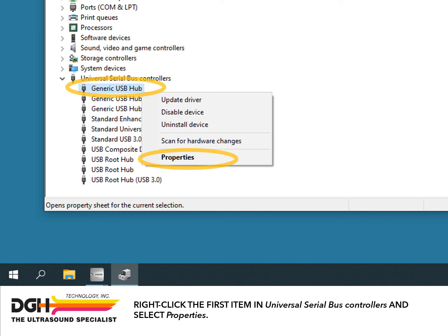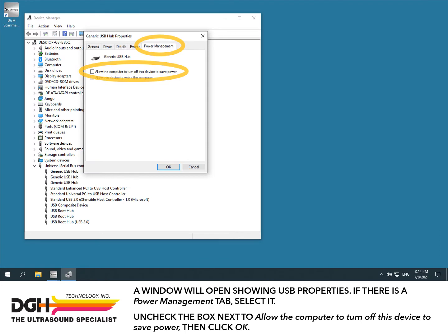Right-click the first item in Universal Serial Bus Controllers and select Properties. A window will open showing USB properties. If there is a Power Management tab, select it. Uncheck the box next to Allow the computer to turn off this device to save power, then click OK.